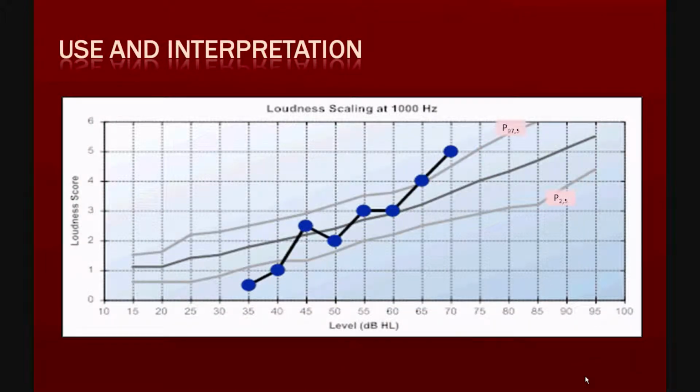How to use and interpret the test results. This test is particularly useful in patients with hearing aids or cochlear implants. Since it is essentially a low-level identification task, this test requires some adaptation to the device. Therefore, this test should not be used at switch on. It is rather recommended to do this test after a couple of weeks or months of adaptation to the device.